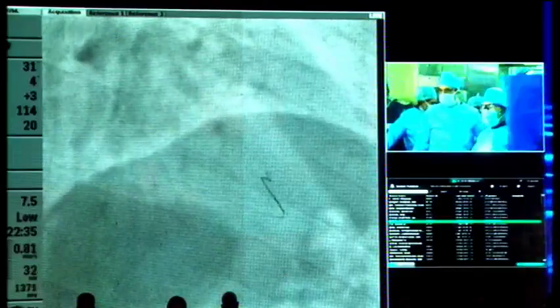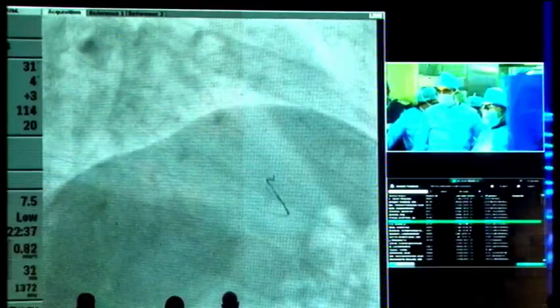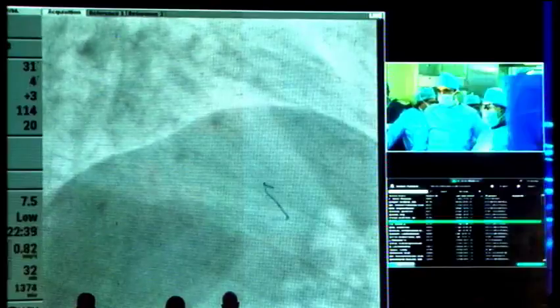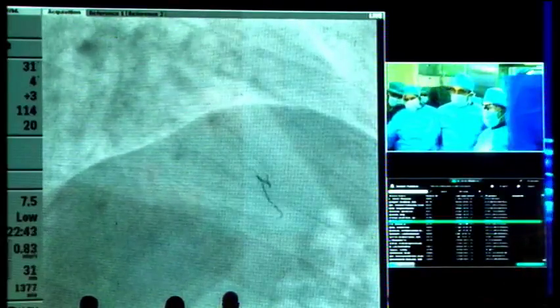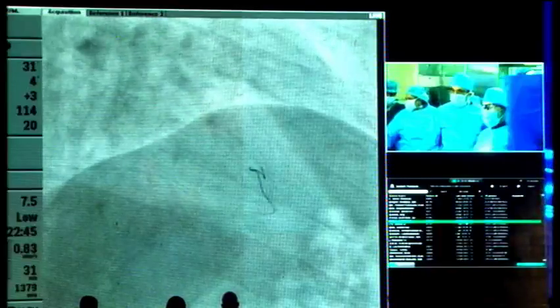But still some resistance there. Yeah, it's a very small connection, as we all agree. Yeah, this tip is.